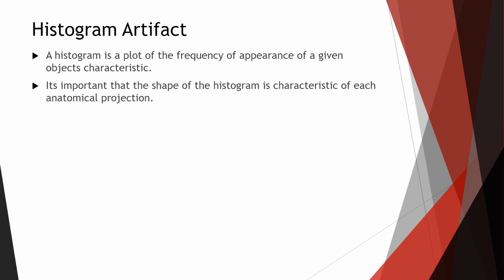Either there's going to be a lot of whites, a lot of blacks, or one big peak in the middle, and it's going to use that and trim all that data. It's only going to focus on a shortened range of data, and then during its digital image processing steps, it's going to represent that. Now, if we have a greater bit of whiteness on the film because of collimation errors and things like that, and it's trying to include all that area, it's going to have another peak of white that it's not expecting. So it's going to try to compensate for that.